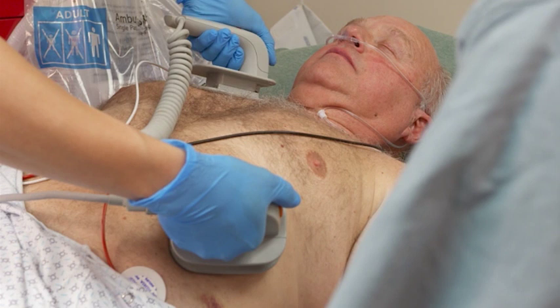In this case, we'll assume we have prepared for both monitoring and synchronized cardioversion using the external paddles and three-lead monitoring electrodes, and have used the lead select button to select an ECG source with a clear signal and large QRS complex.